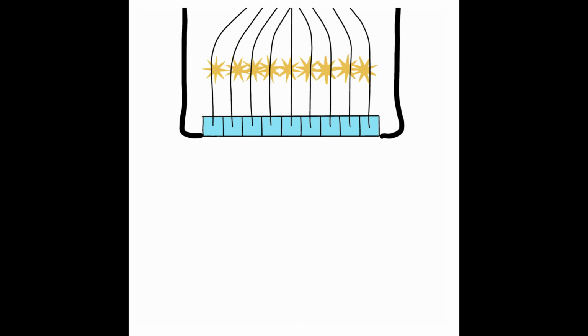So again, we have all of our pulses coming down, hitting the crystals at the exact same time, sending that pulse out, and we are getting an unsteered beam. It is coming directly from the face of the transducer, from that kind of front line of the pulses.